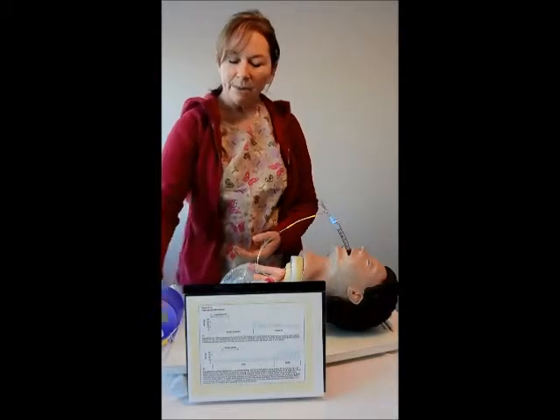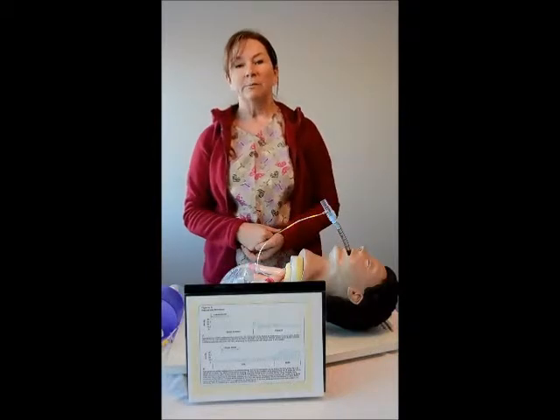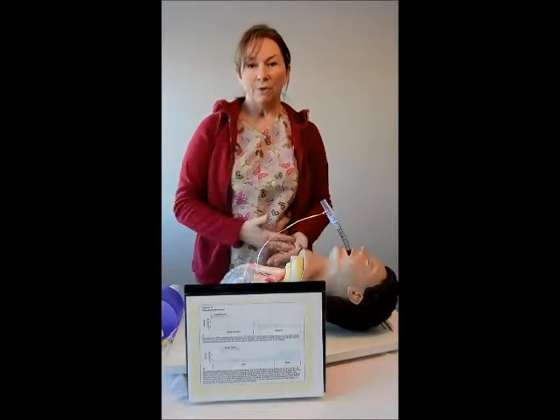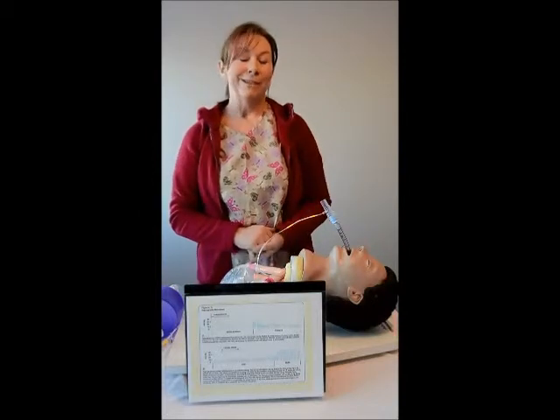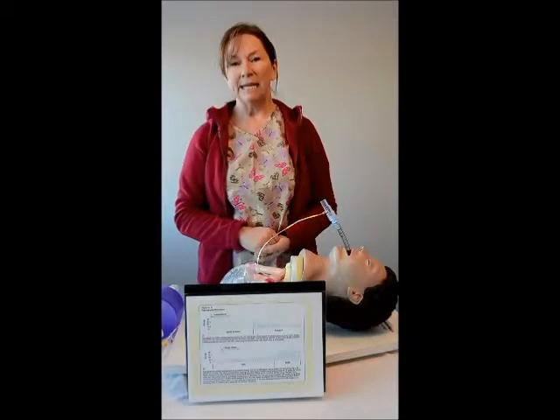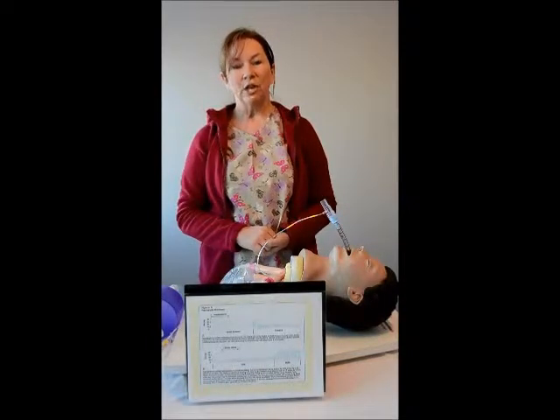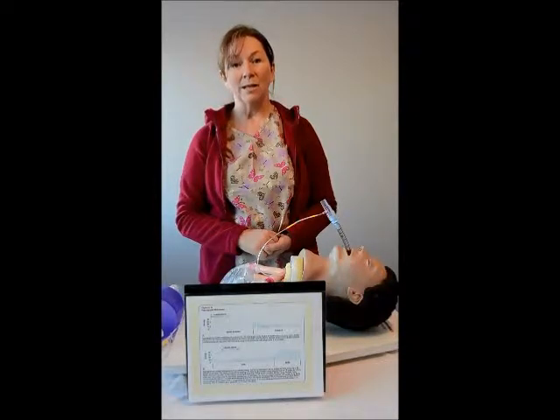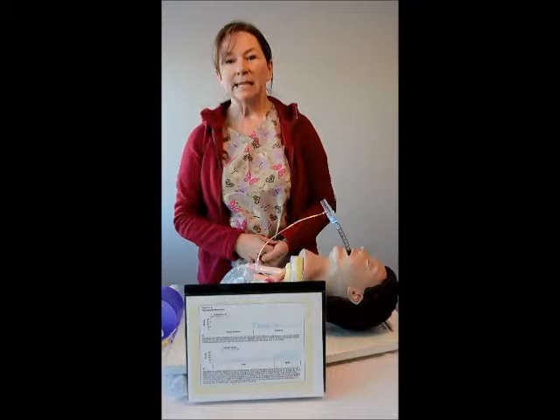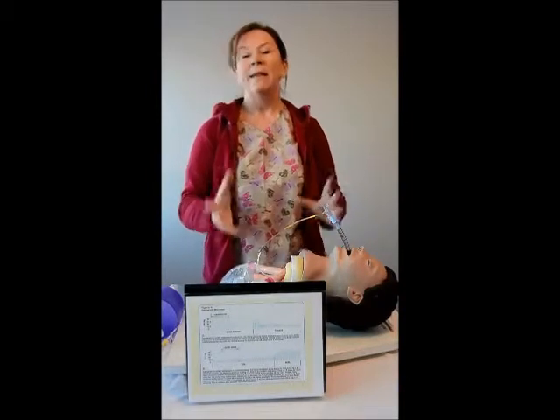And you can see on the bottom part of this waveform capnography that whoever was doing compressions during this time was becoming tired. Somebody took over and the compression, or the CO2 number increased to greater than 10. The last part at the bottom of the chart shows the patient who has ROSC, or return of spontaneous circulation. So that is an indication in which we can stop doing CPR, do a pulse check, and then manage the patient's airway and breathing.